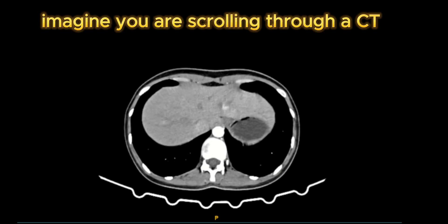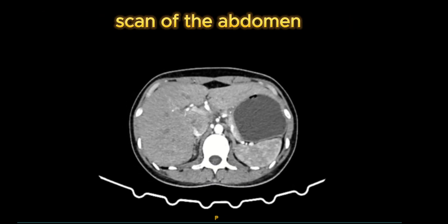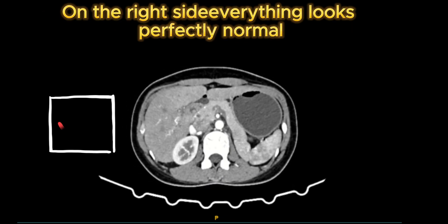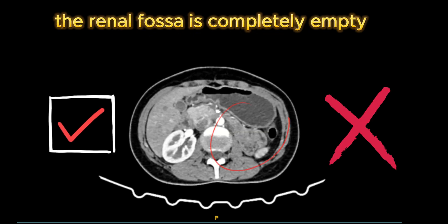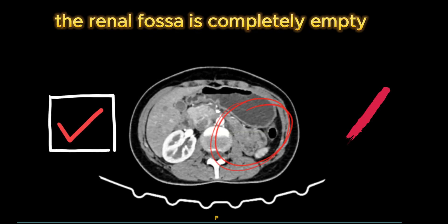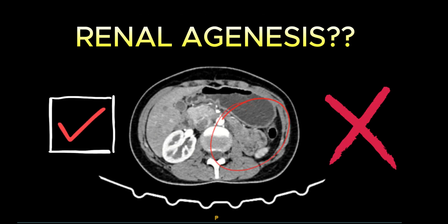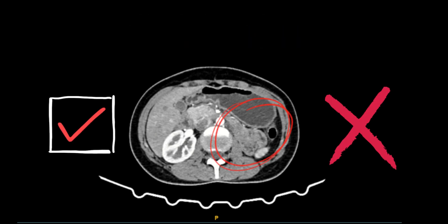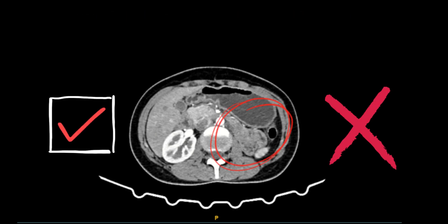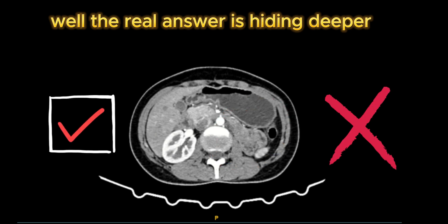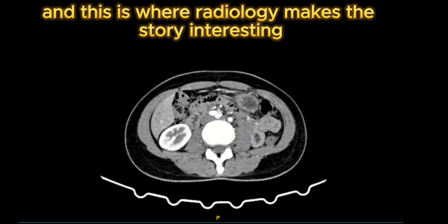Imagine you are scrolling through a CT scan of the abdomen. On the right side, everything looks perfectly normal. But when you look at the left side, the renal fossa is completely empty. There is no kidney at all. So is this renal agenesis or did the patient lose a kidney? Well, the real answer is heading deeper, and this is where Radiology makes the story interesting.